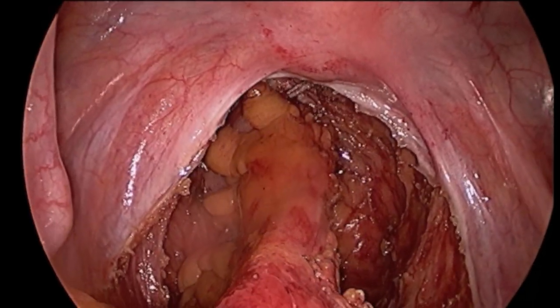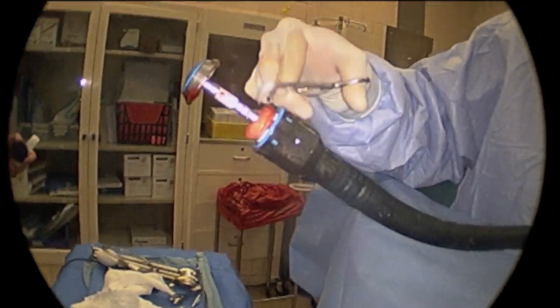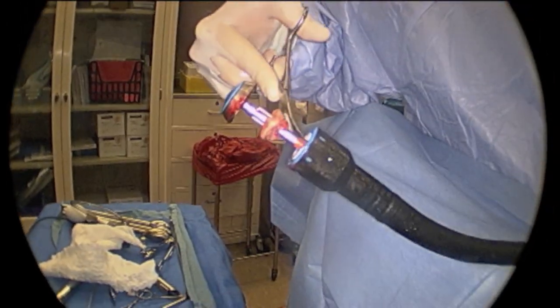The device is then opened, extracted, and the shaft inspected for two complete rings of tissue — one from the sigmoid and one from the rectum.